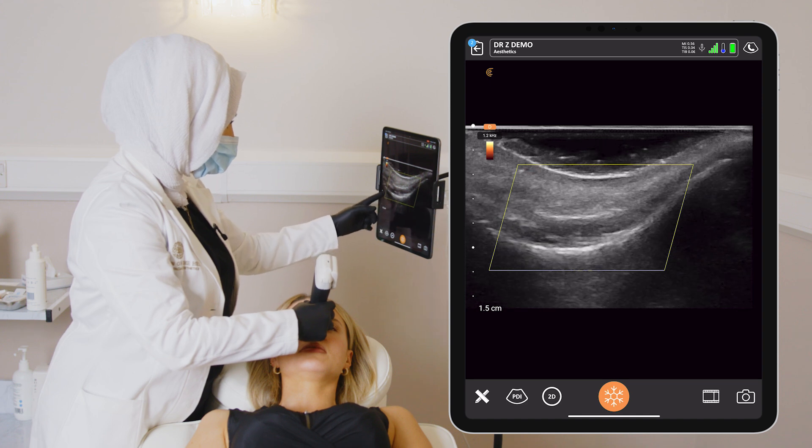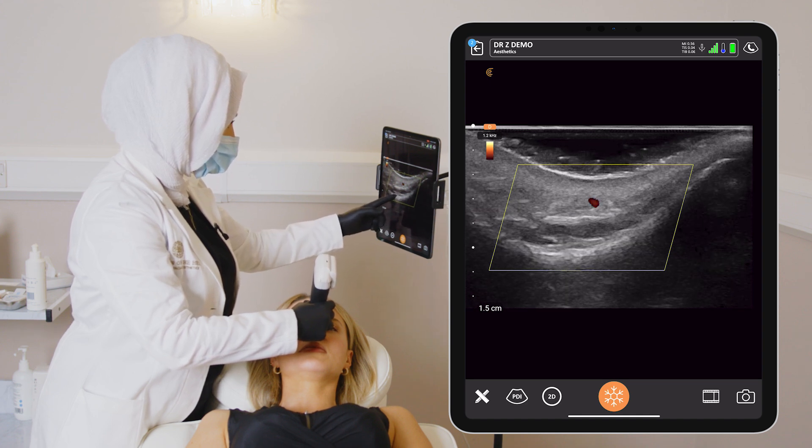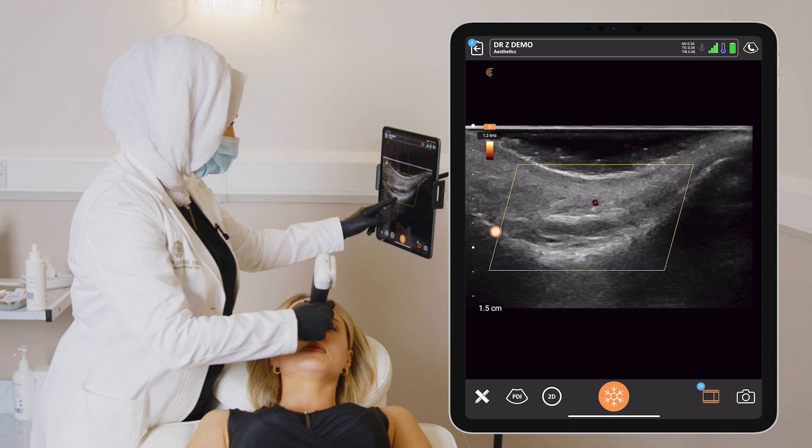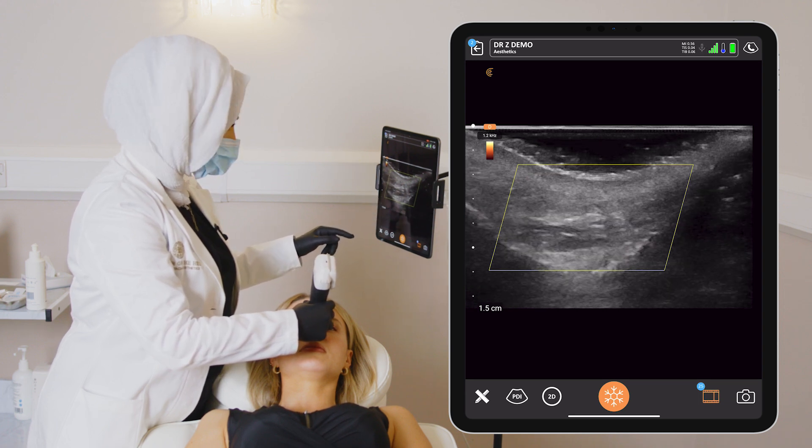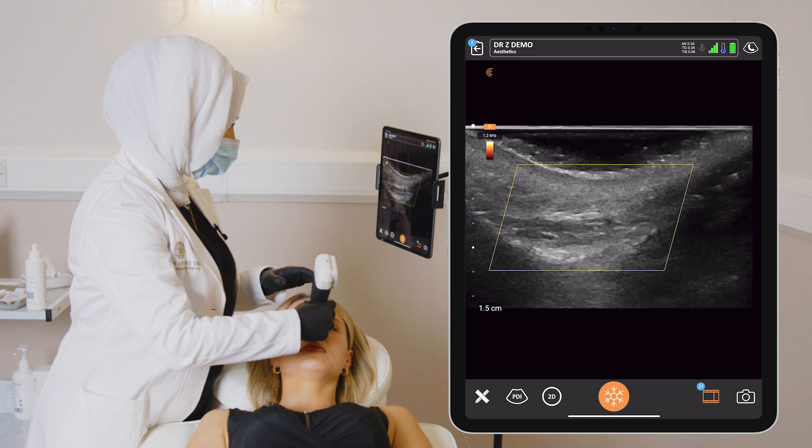Beautiful appearance here of all the layers in the radix, from the hyperechoic line showing the periosteum, the deep fat — a very thin layer — a little bit of muscle. The procerus muscle would be here.